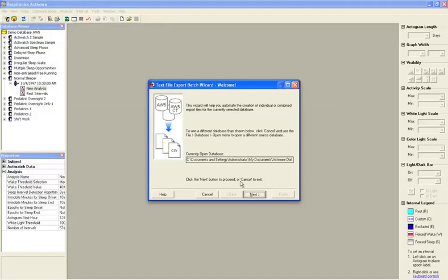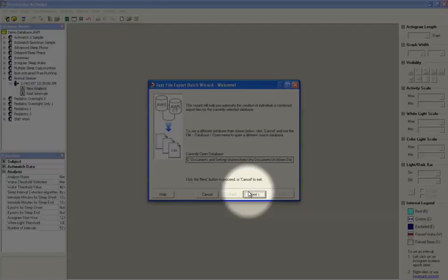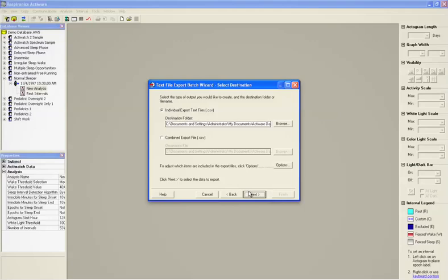At this point, you'll be entered into the Text File Export Batch wizard. Select the Next button and then determine whether you want an individual export file or you want to combine the export all into one file.